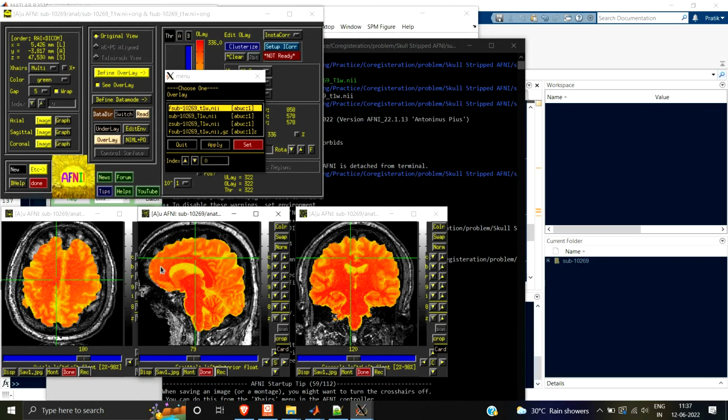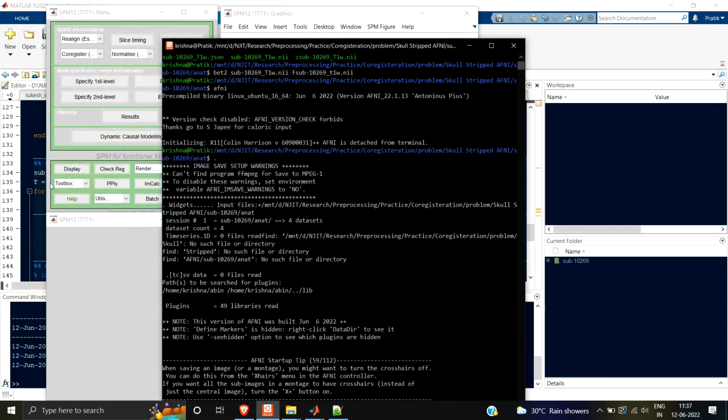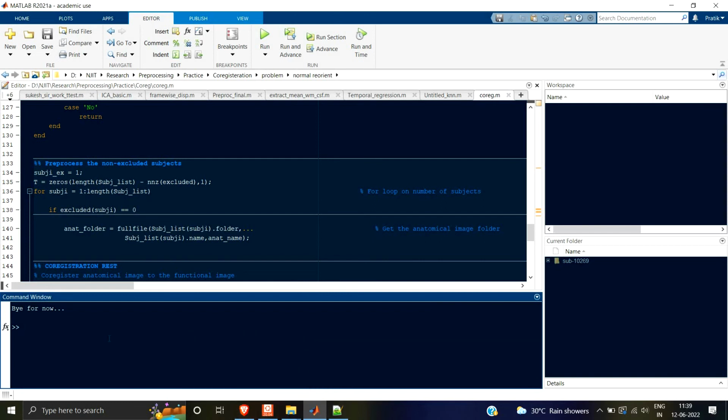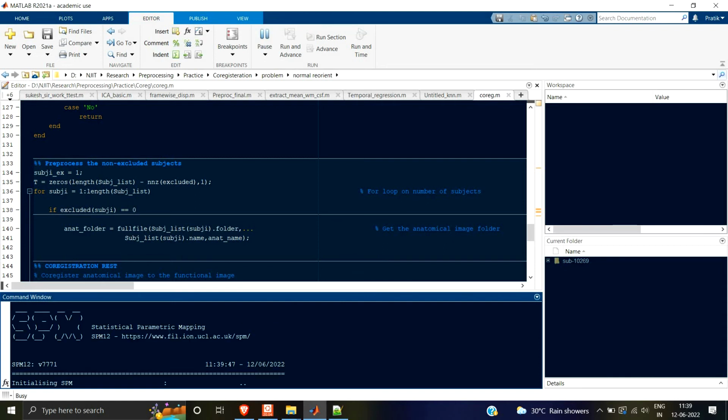However, we just want to co-register this to the rest image, so it is fine. You can just choose an option depending upon how accurate you want to be, and then take a call. Okay. So once you have extracted this, let me just quit. Once you have skull stripped, you can just co-register both of them again.